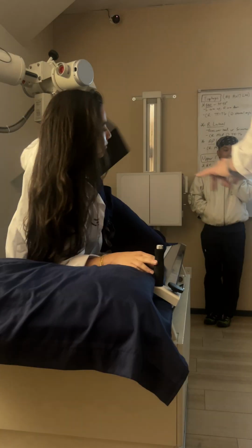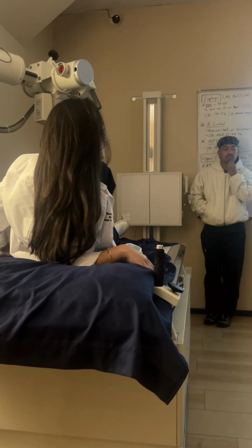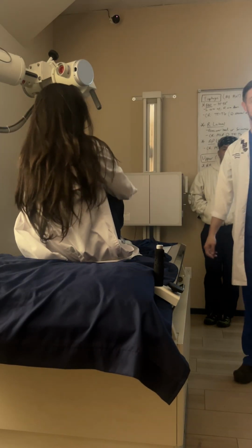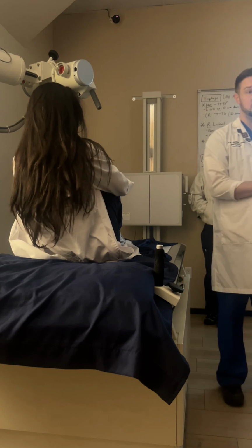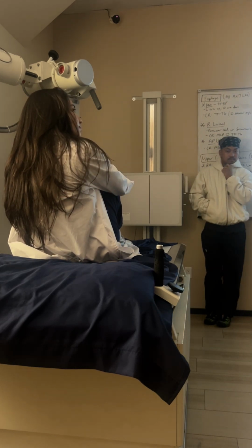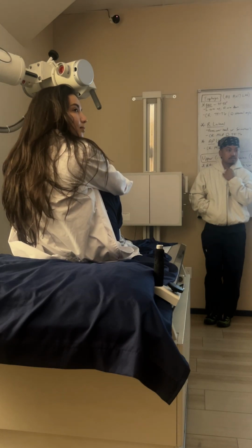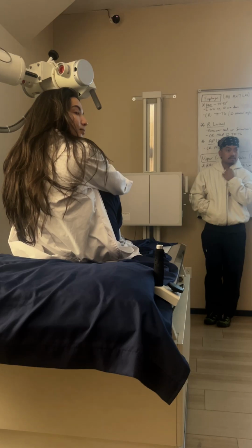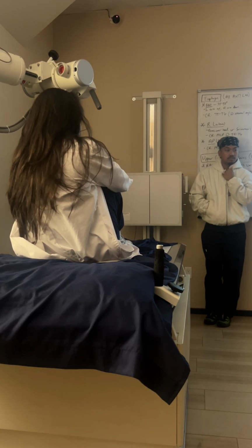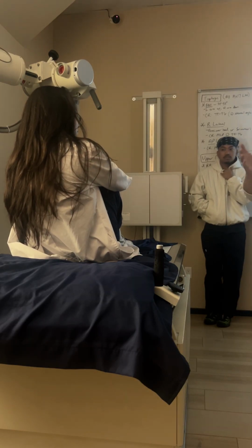So you would go get your mock patient and you would say, "Hi, Miss Majdalawi, are you here for a barium enema today?" Yes. Great. I'm going to be your technologist today. So what we're going to be doing is called a barium enema, as you already know. Basically what we're going to do is insert a small tip, just a little bit, about this much, into your rectum, and we're going to use that tip to put this white liquid into your bowel, okay? While that barium is flowing into your bowel, the radiologist is going to be taking pictures, having you turn in different positions on the table.